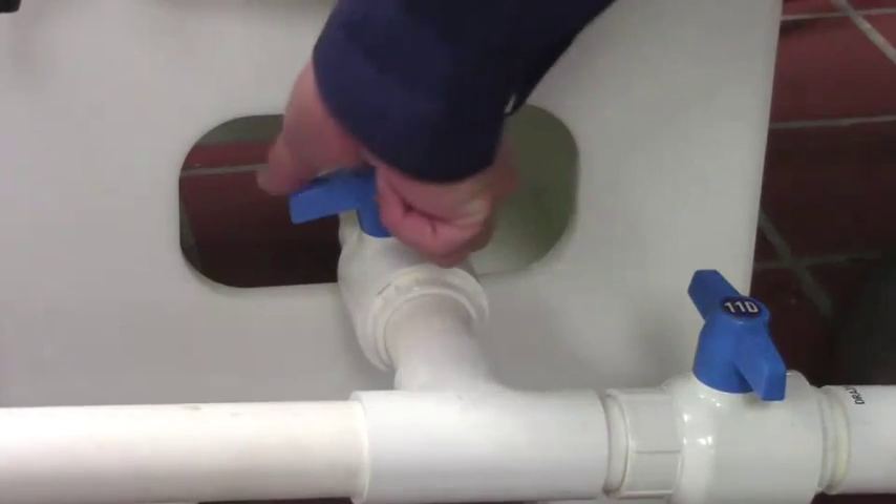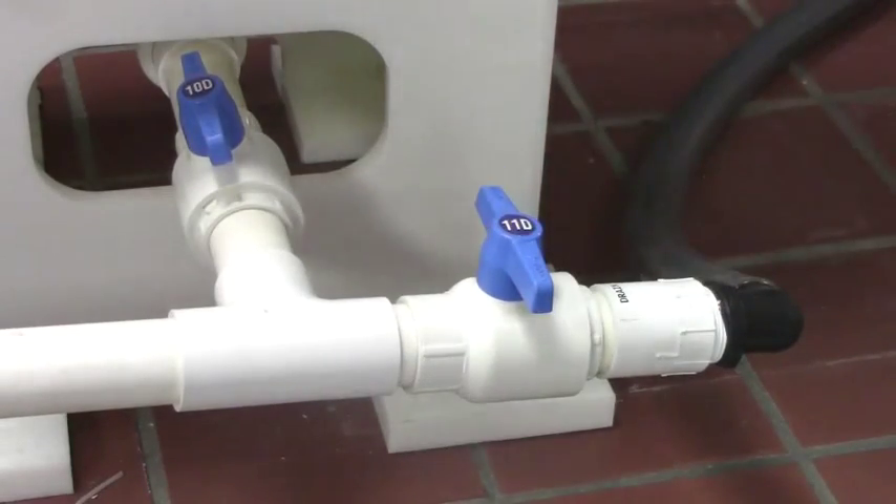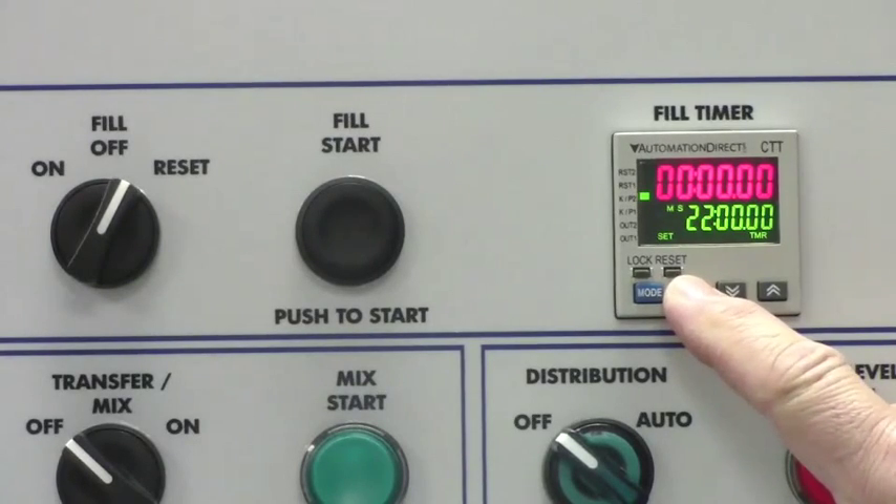Open valves 10D and 11D to drain the distribution tank. Then close 11D. Set the fill timer to 2 minutes.